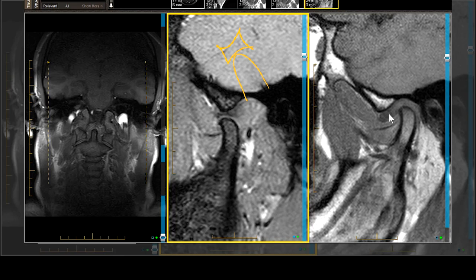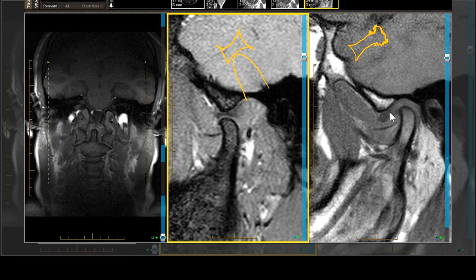You may have a meniscus that looks too long. The meniscus looks okay and then all of a sudden some other tissue gets in there of the same signal intensity, but it keeps going and makes a little mass — that's scar tissue in the attachments that elongates the meniscus and makes it look like it's in the right position. Because this area, and this area, and this area would all be dark, this is known as the pseudo disc pitfall.